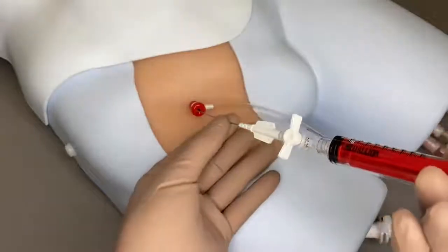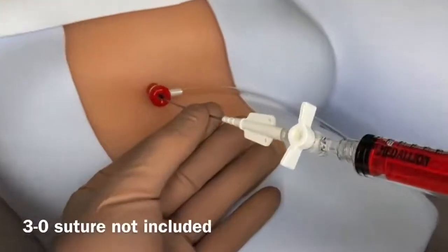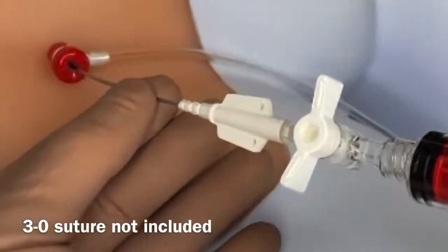Close the stopcock. Hold on to the device hub to prevent migration and use suture tabs if desired.